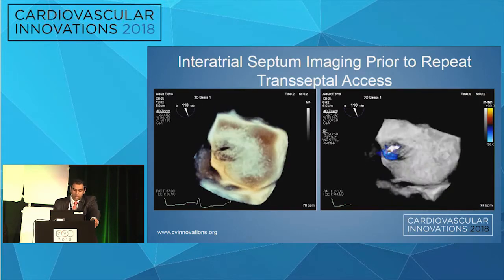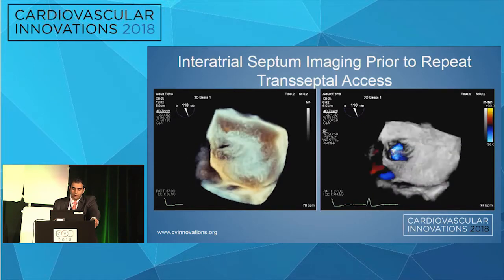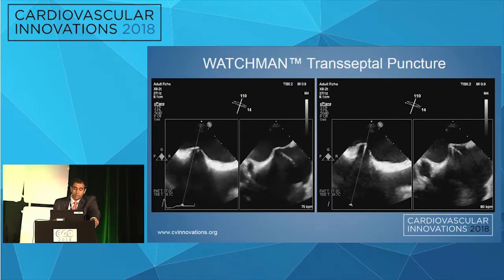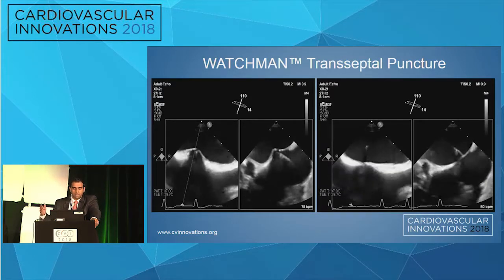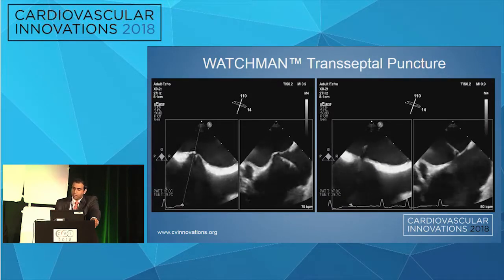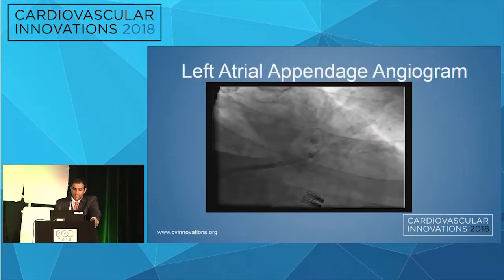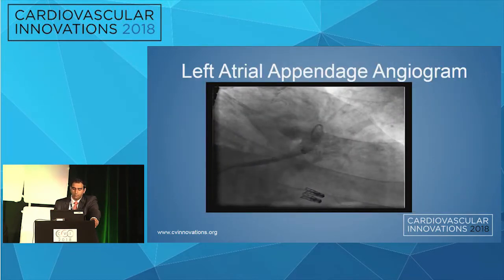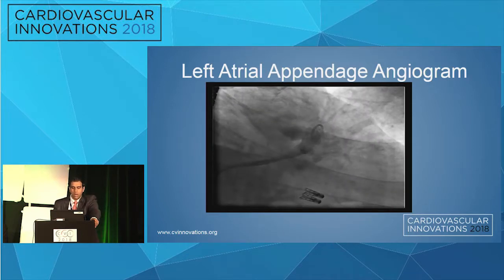You can see the location of the puncture, perhaps not in an ideal location for a standard left atrial appendage case, on top of which this appendage was an anterior chicken wing. So going with a Baylis system, but not really puncturing per se, I directed it where it had to go. I think I applied a little bit of radio frequency, but it went right through the same hole. You see the anterior chicken wing here in this RAO caudal projection, a left atrial appendage gram.